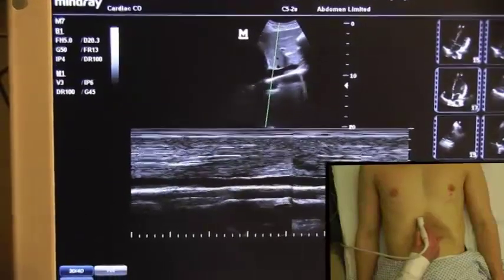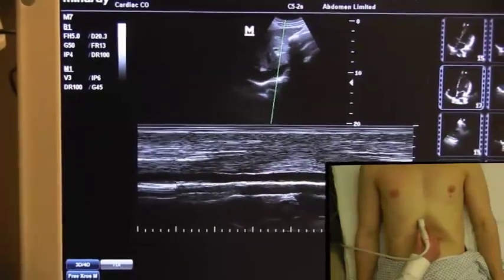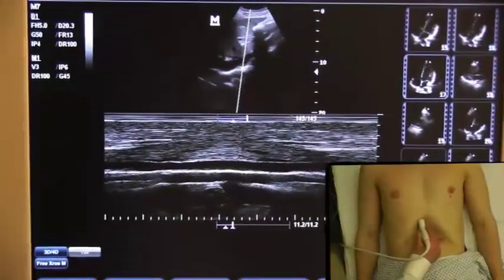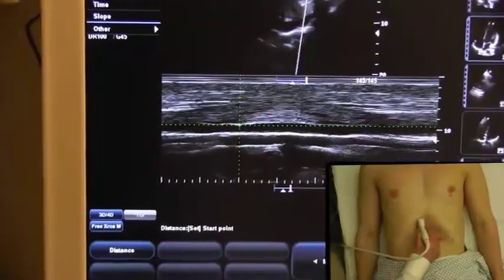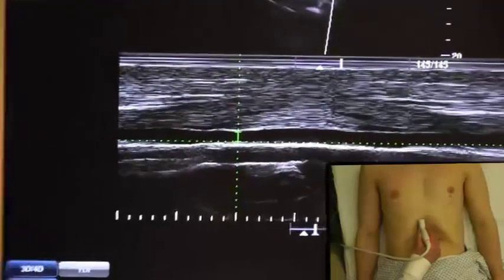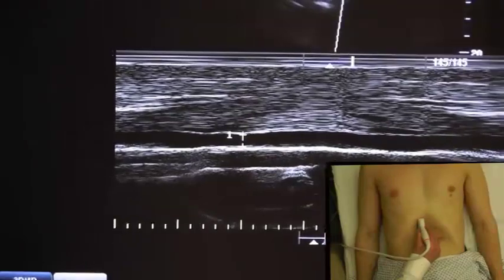M-mode will then allow me to measure the change in respiratory variation of the IVC. If the patient is breathing spontaneously, I can either wait for them to take a breath normally, or I can ask them to sniff in with a forced inspiration.